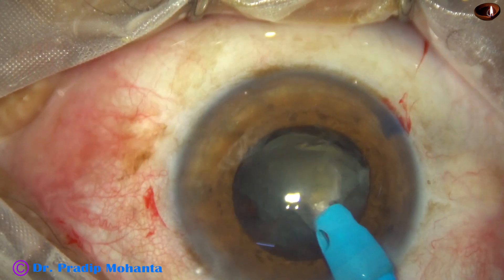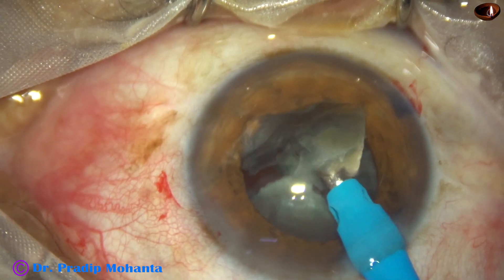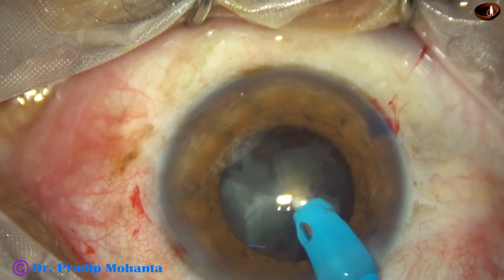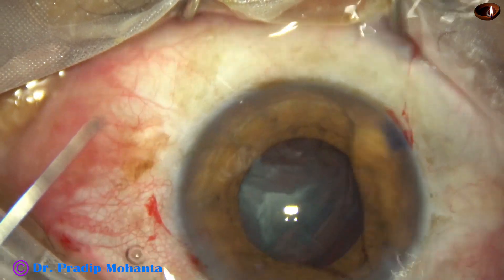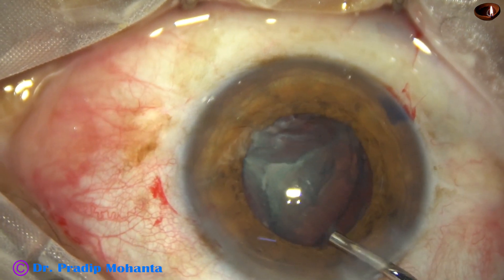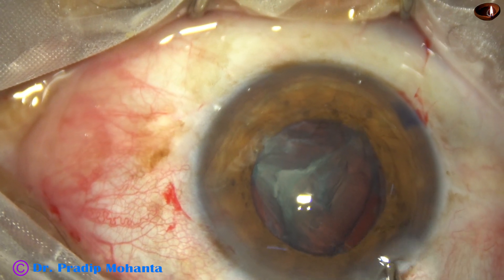I use only the feco-needle and emulsify these 2 pieces. This single-handed management of the nucleus keeps the pupil round. There is no iris injury, there is no stromal atrophy. Size of the pupil is maintained to about 4 millimeters in such cases, and the case gets managed nicely.